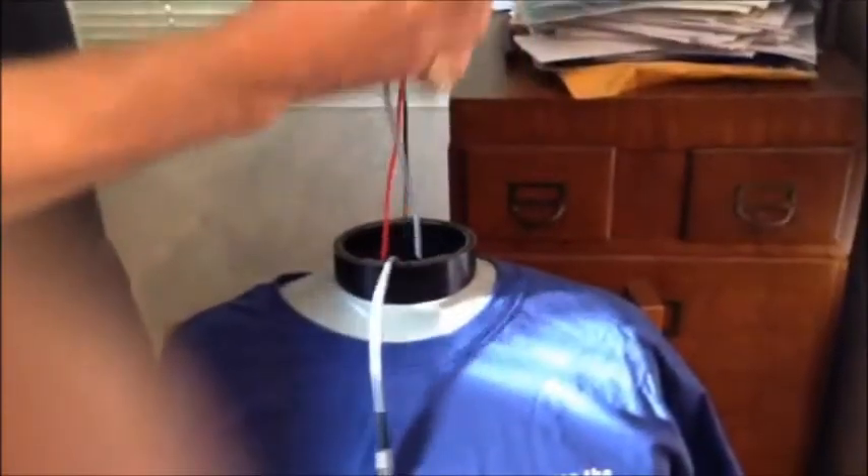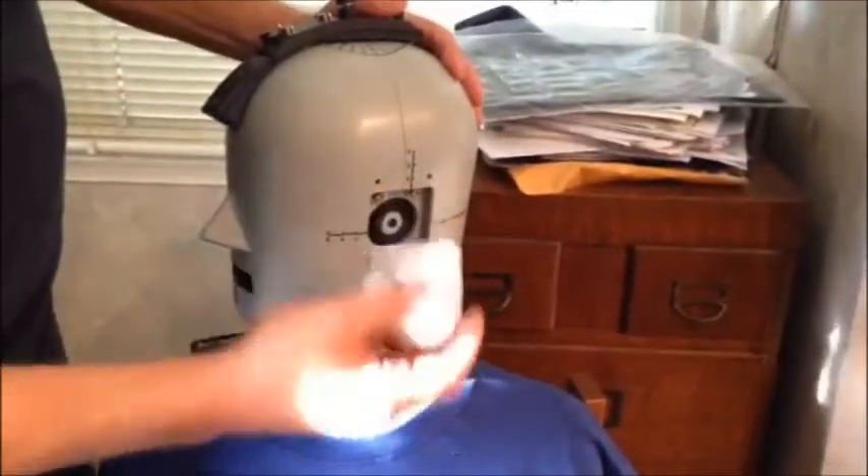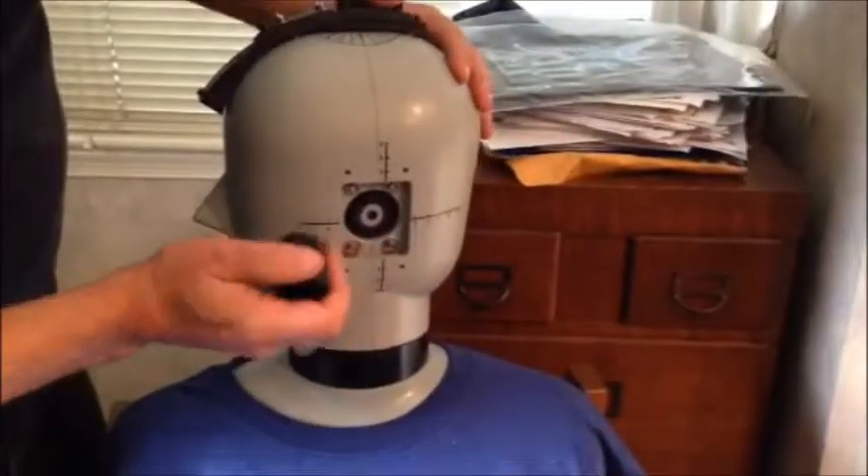Now I can put the head back onto the torso, and now I can remove the pinna to expose the coupler.